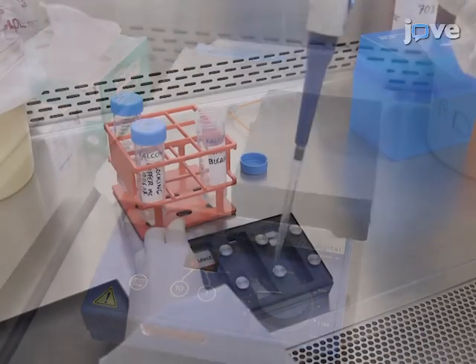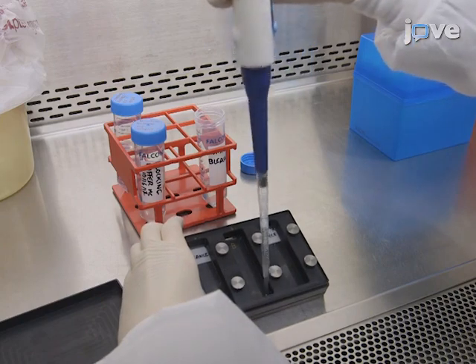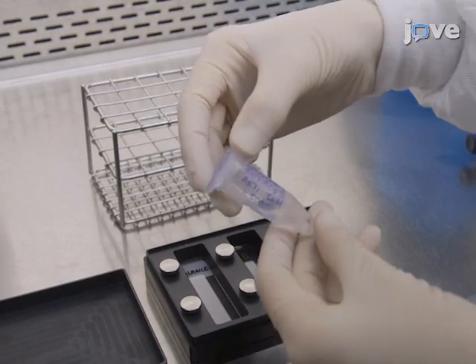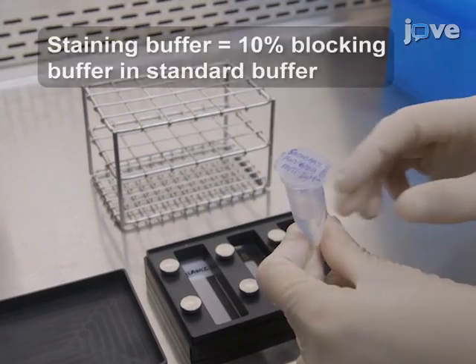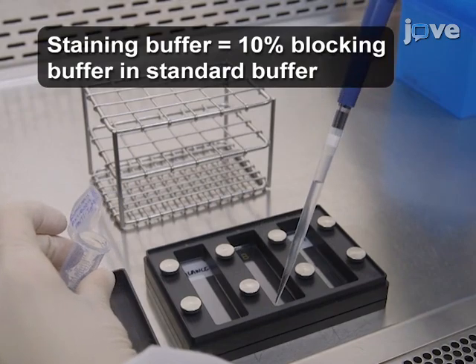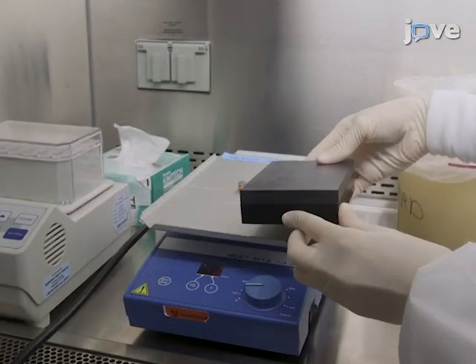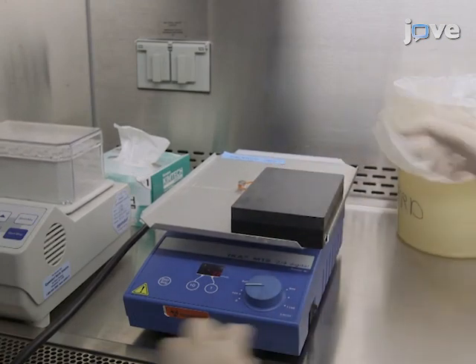Remove the blocking buffer by aspirating from the corner of the microarray chamber with a pipette. Add anti-human IgM fluorochrome conjugated secondary antibody diluted 1 to 5000 in the staining buffer to the microarray. Then incubate the microarray for 30 minutes at room temperature in the dark on an orbital shaker at 140 RPM.